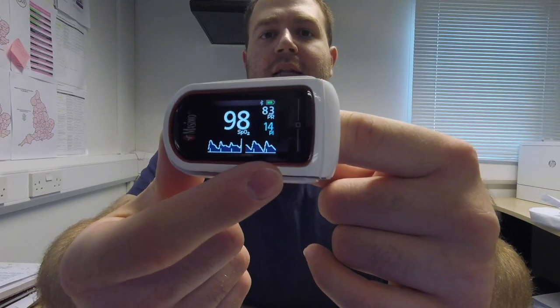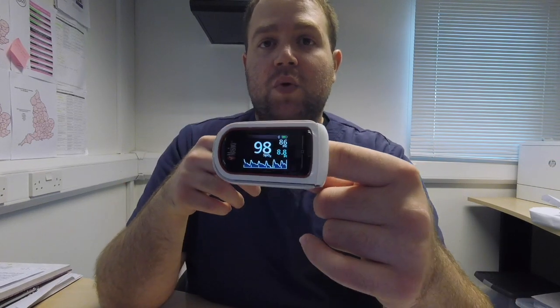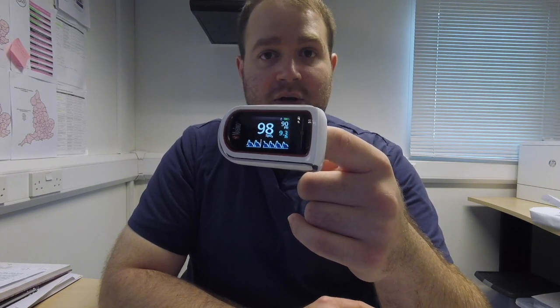On the screen you can see the saturation, pulse rate, perfusion index, and plethysmographic waveform with little vertical lines that represent the Signal IQ. This device has both Signal IQ and SET — Signal Extraction Technology. This allows the device to get a good measurement even with low perfusion or motion artifact, which are the two situations where normal pulse oximetry usually struggles.